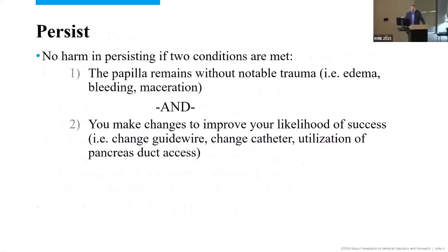So when we think of persisting, my approach is generally there's no harm in persisting if really two conditions are met. The papilla remains free of any significant trauma. You don't have much edema, you haven't gotten into any bleeding, you haven't turned the major papilla into a hamburger patty. It's totally fine to go forward.